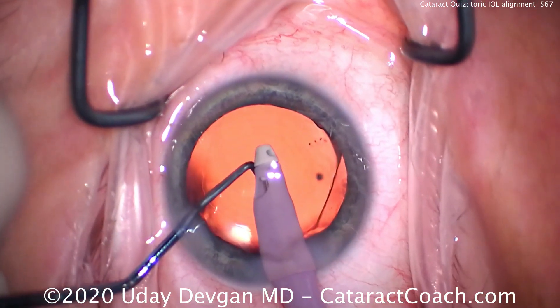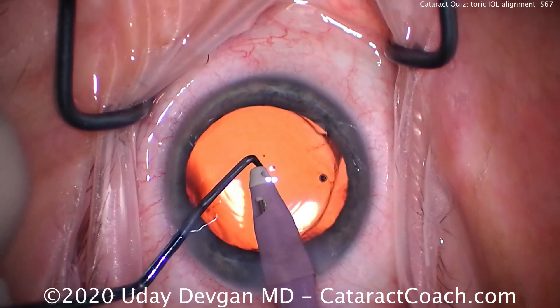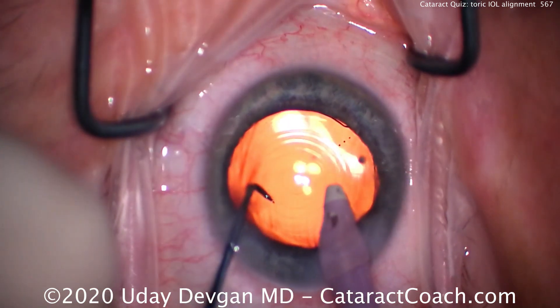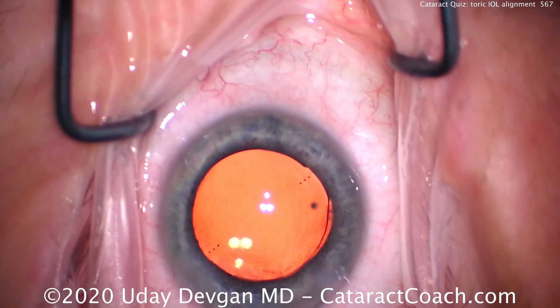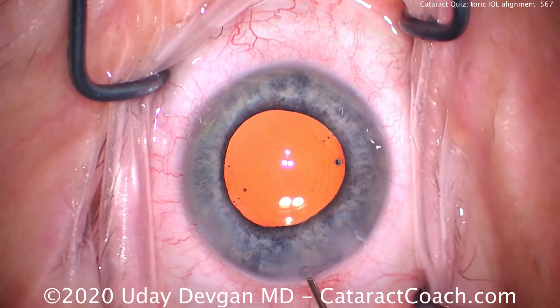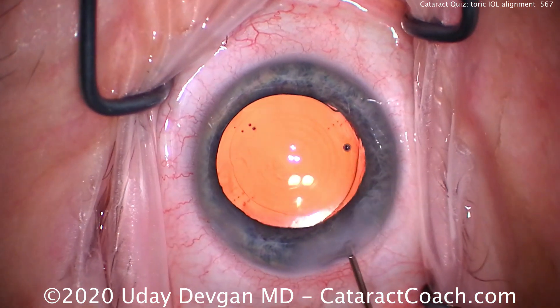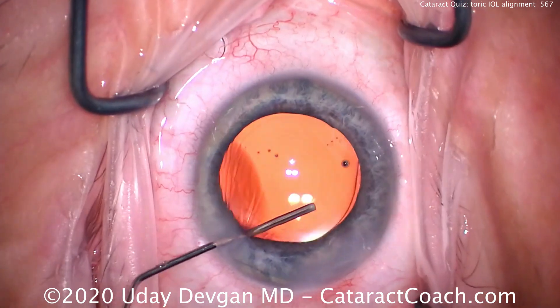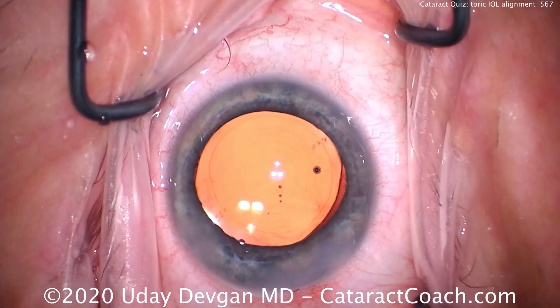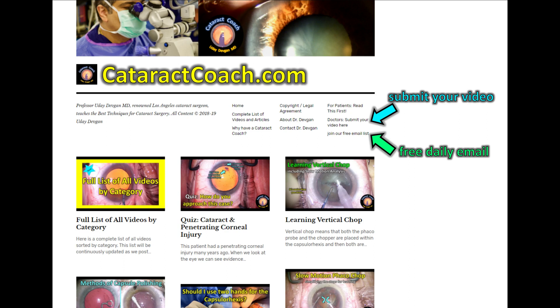There are the marks on the cornea, and there are the marks on the IOL. In a certain position they line up beautifully, but what if I have to shift the optic in order to line up the central diffractive zone with the pupil? We're going to use those Purkinje images to shift the IOL over, keeping the lens at that 120-degree meridian but simply moving it in parallel. That gives us good centration of the lens and the diffractive rings in the pupil, while also maintaining proper orientation of the toric power. You can see that parallel nature of the toric marks on the IOL and the marks we made on the cornea — they're very nicely lined up, not fully overlapped but parallel, and that's very appropriate.